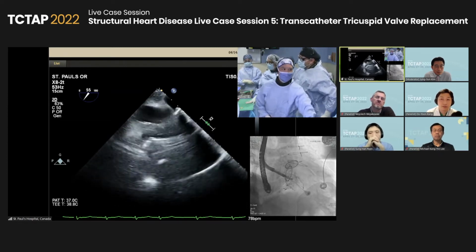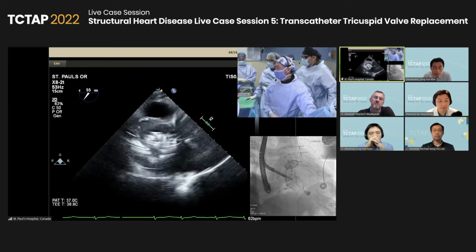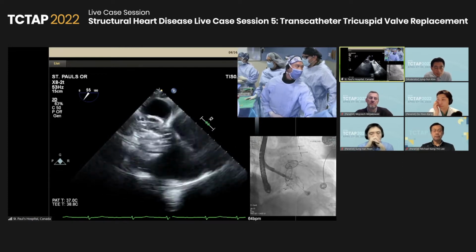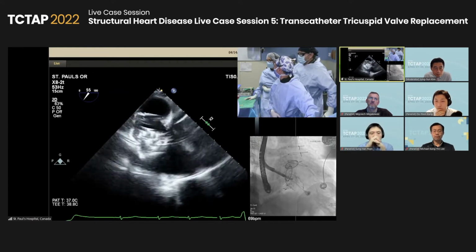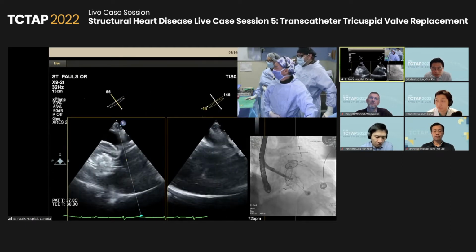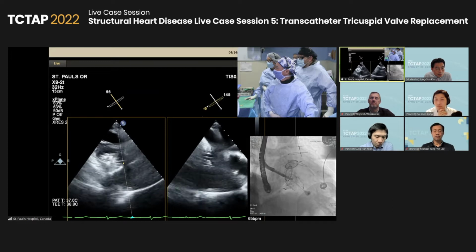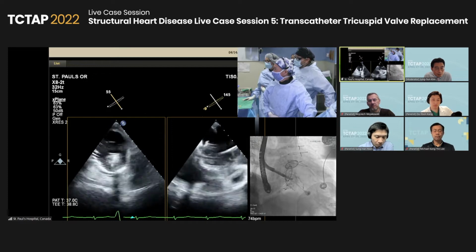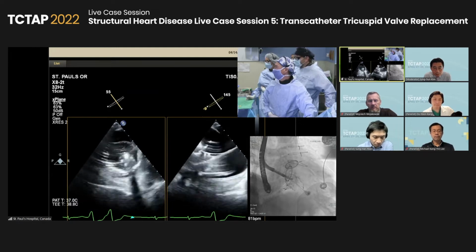You want to go back to the other one where you're actually seeing some septal tongue? The one prior to this, not the 0 degree, the other one that you have. One where it's at a higher angle? Yeah, thank you. Let me just see if I can bring it on better in this view here. So on the fluoroscopy, you can appreciate the septal tongue. You can also appreciate the mandrel that comes through the middle of the device. And so on echo, both of those things appear bright. That's part of the issue, trying to figure out where you are. You can see below the valve, and there should be two bright objects, one that's against the septum and then the mandrel from the center of the device.